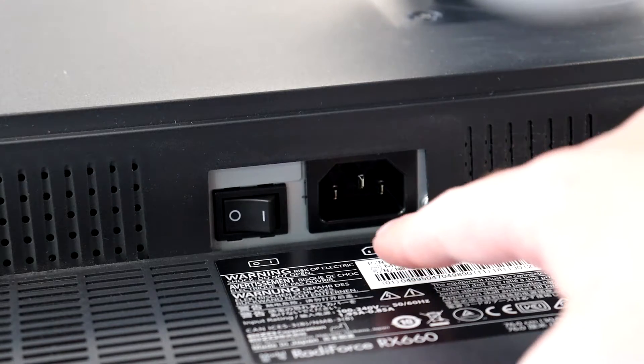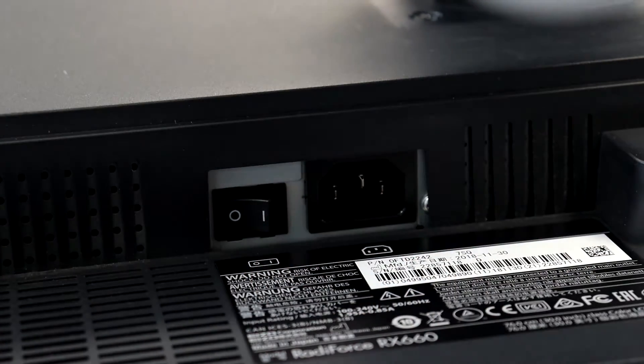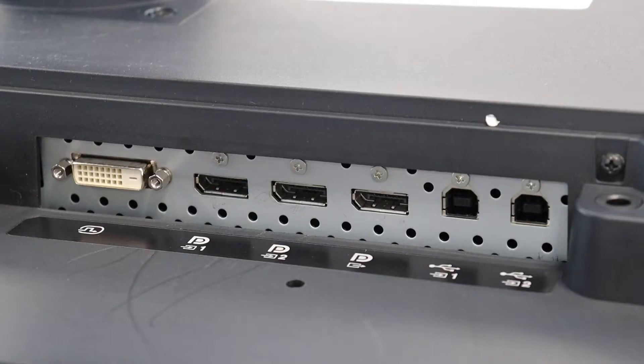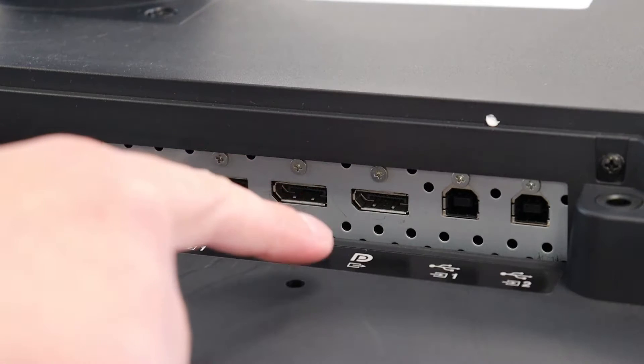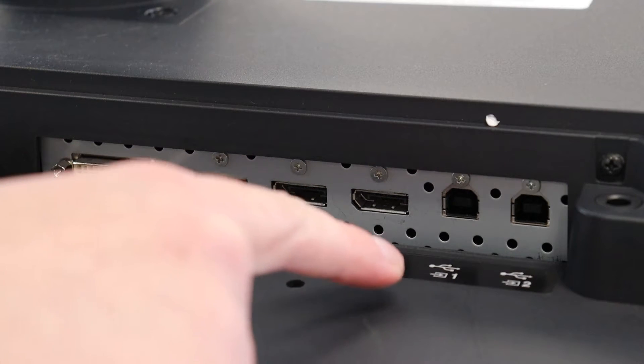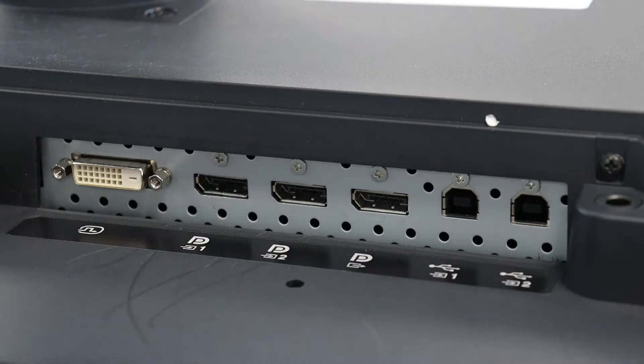Here are the input and output connections found on the rear of the unit. Starting with the power connector and rocker switch, one DVI input, two DisplayPort inputs, one DisplayPort output, and finally two USB upstream ports used to control the monitor via ISO's Radix software.